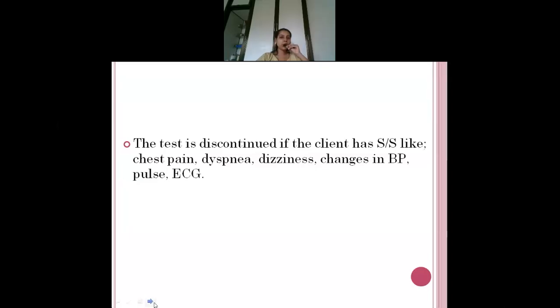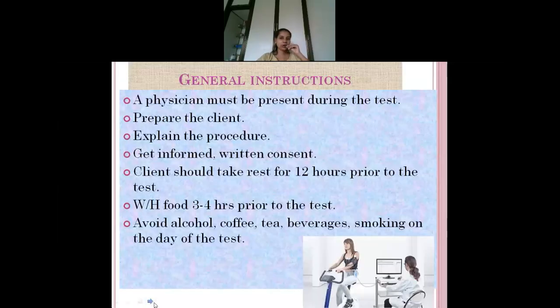So if they have any changes in the vital signs, or if there are complaints from the patient, like pallor, chest pain, dizziness, or they are feeling palpitations, immediately you will have to stop the procedure.